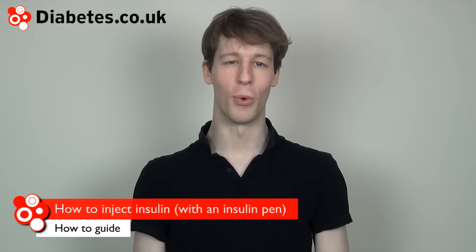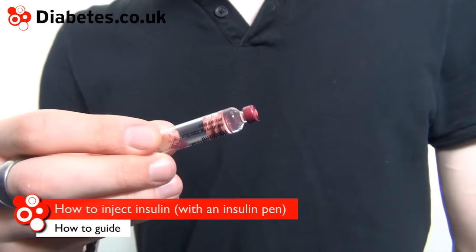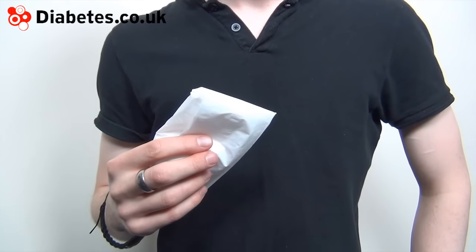To do an injection, you will need an insulin pen, enough insulin for the dose, a new pen needle, and cotton wool or a tissue.